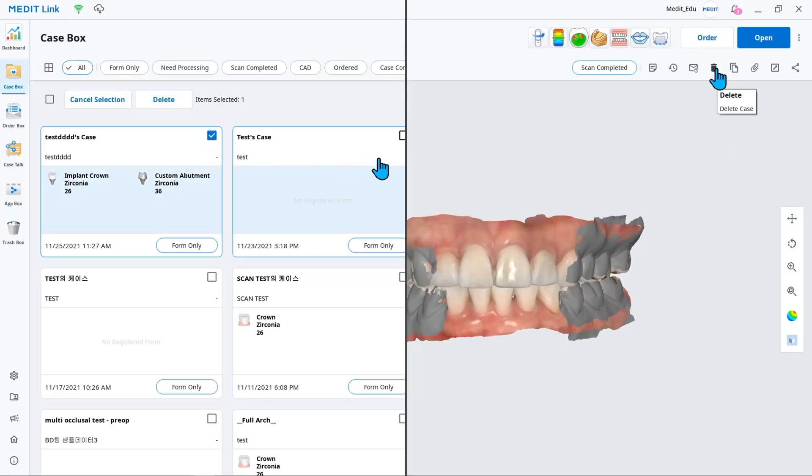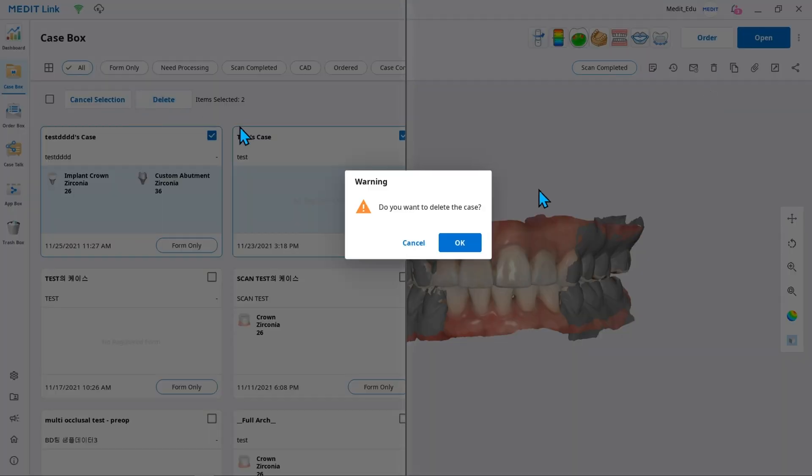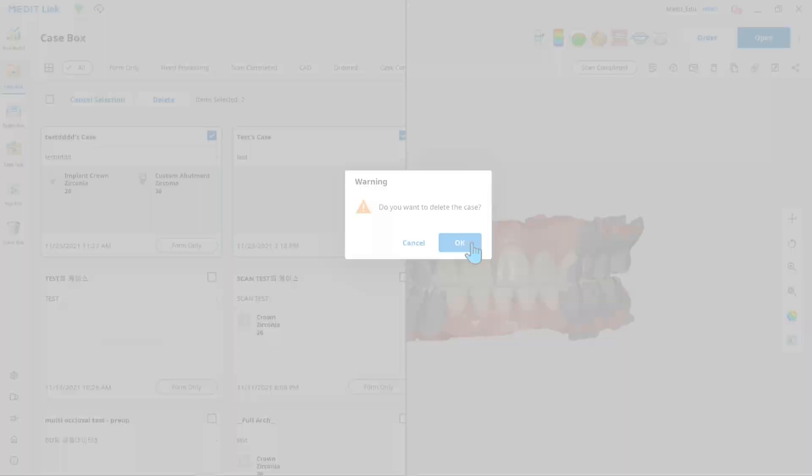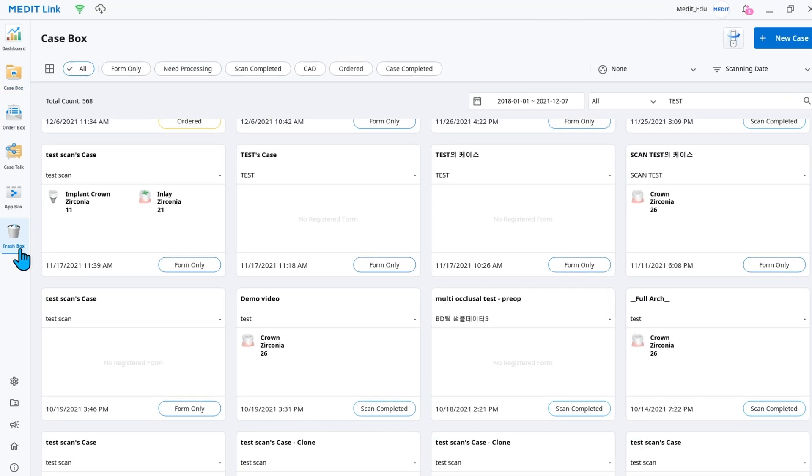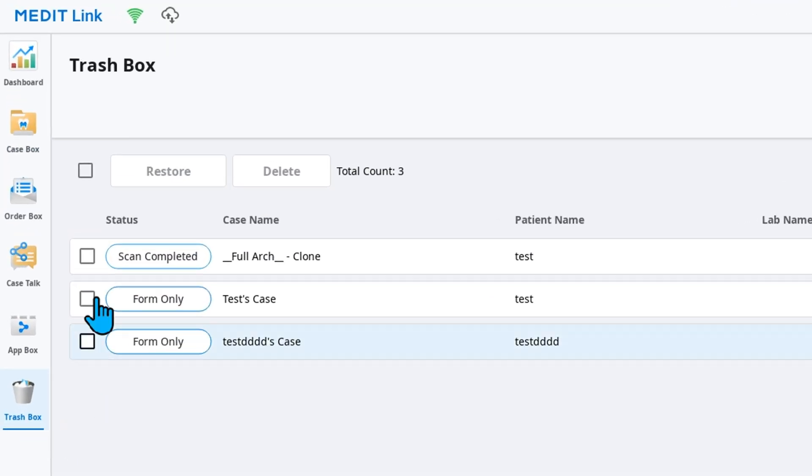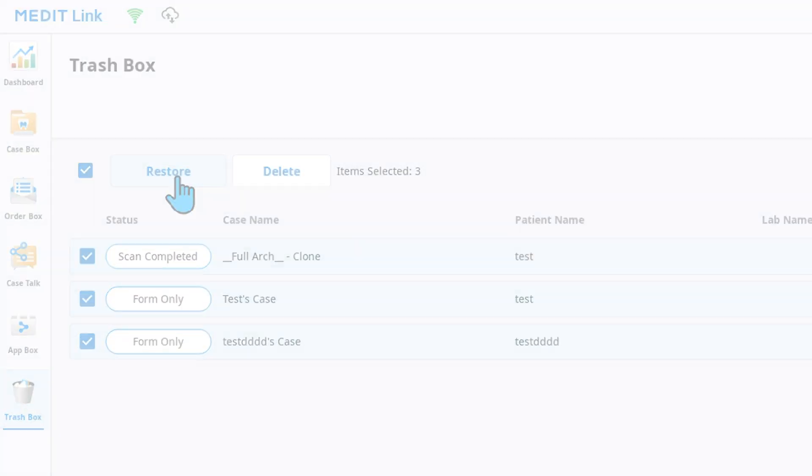Note that these two options will delete files only from your cloud storage. If you have accidentally deleted the wrong file, it can be restored from the trash box.